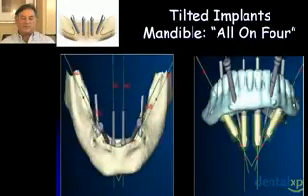With the planning software, we can actually position implants in parallel, or we could deliberately tweak the implants into an angled position. There's a measurement tool that will tell us what angulation the implants are next to each other. You see the 2 middle implants are parallel to each other, and the measuring tool would say 0 degrees. They're exactly parallel to each other. For an all-on-4 case, we could tweak it, and it works out quite nicely. Then you would use a pre-planned available abutment that comes in the software itself of 30 degrees to reorient it so all of the implants will emerge right through the occlusal aspect of the case.